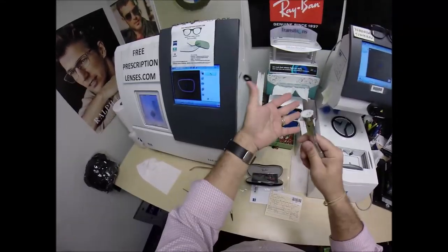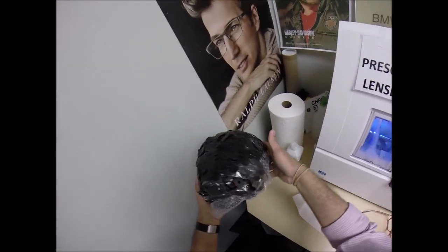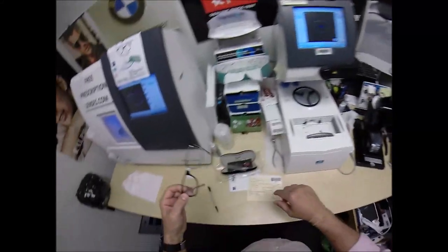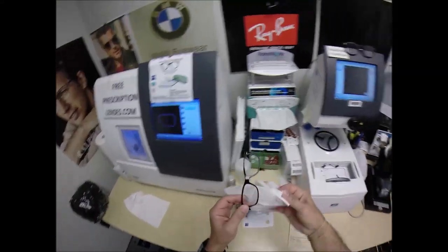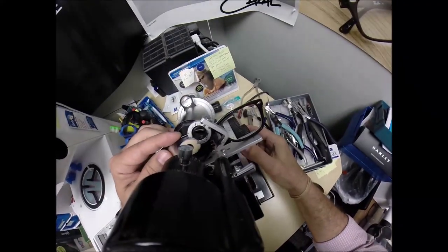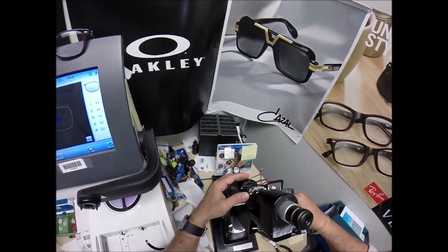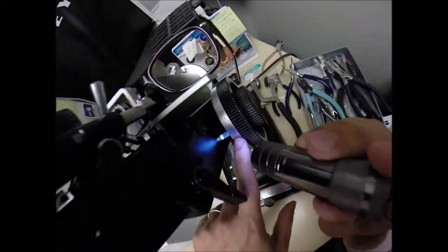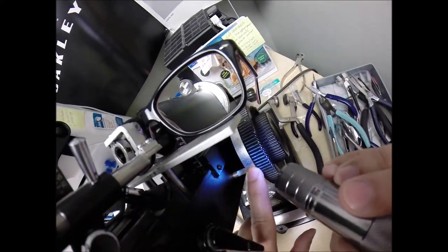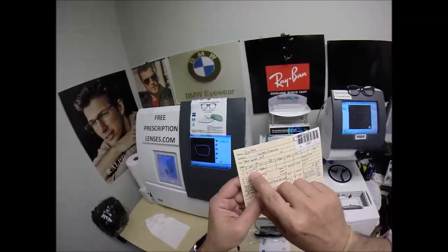I'm going to pull the sticker away, dry it off, and add to my sticker collection. I'll put a new lens on the lensometer, place it in there, read the power. I'm getting minus one — the red minuses, not the black positives. That's because Victor's prescription is minus one.